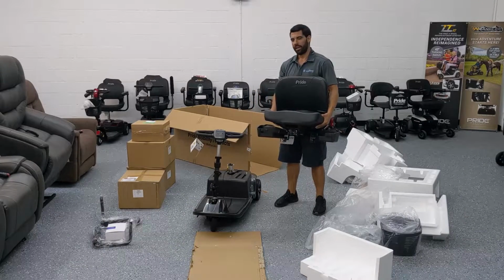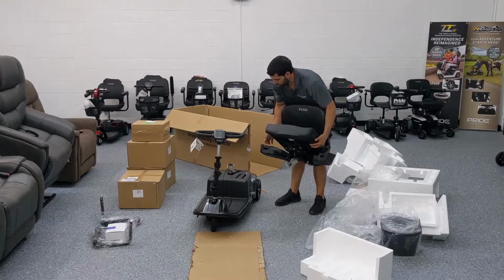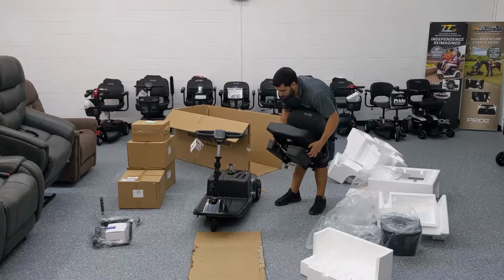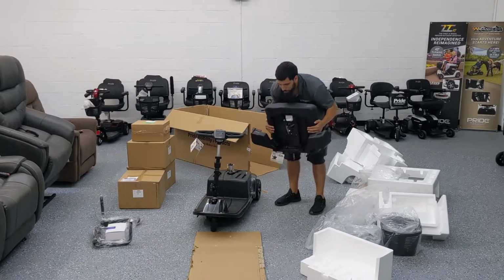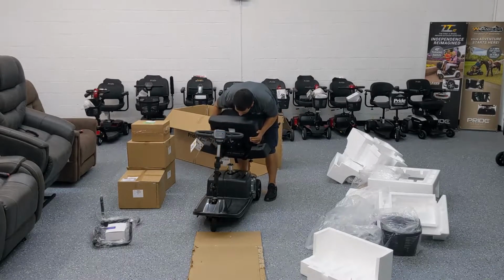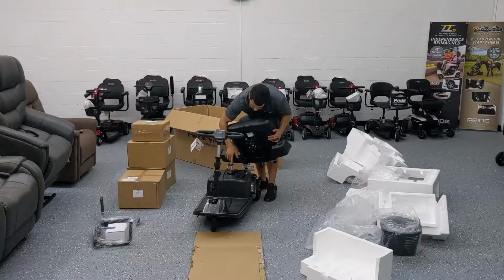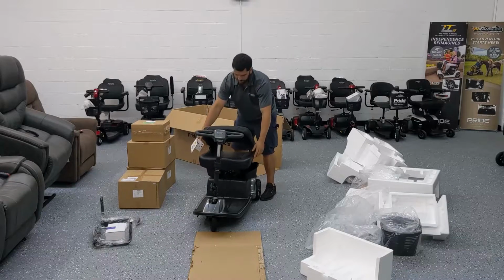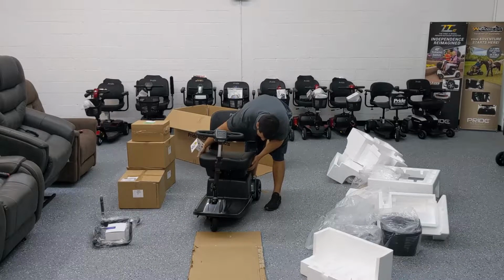So, all right, now that the batteries are on, it's time to put the seat on. The seat comes with 2 under storage containers which swing out, and you can put your keys, your wallet, phone, whatever you want in there. They do have to be swung open like this in order for the seat to go on initially, so make sure that they're open. There's a little male insert and the female receiving end. Just go ahead and make that connection there. The seat falls into place. There's no tool necessary for this.